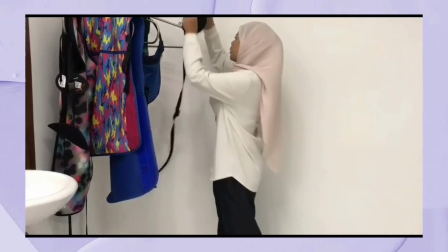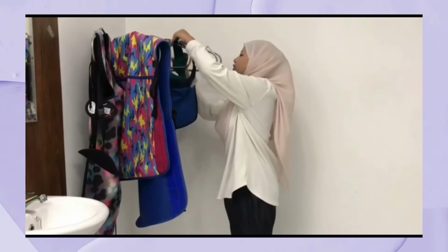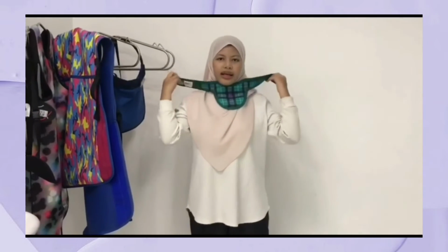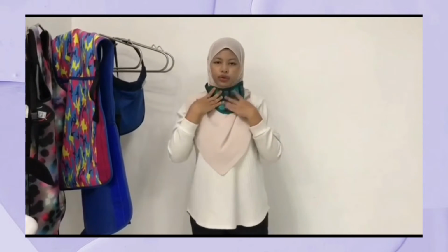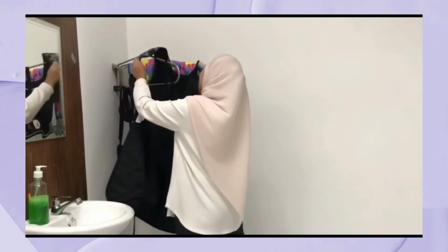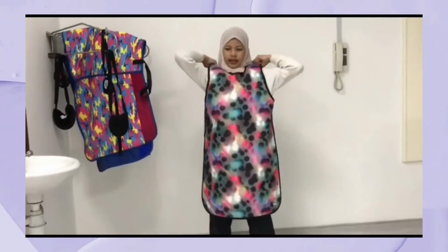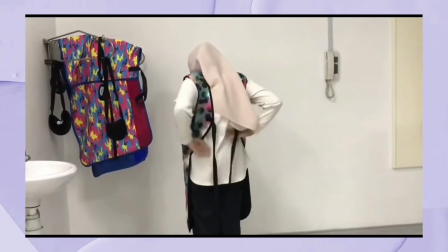Other than that, we have this shield. Okay. This is the thyroid shield. It must be worn at your neck area to protect the thyroid. So here is the lead apron. Okay. You wear it at the front, okay, and clip it at the back side of your body.